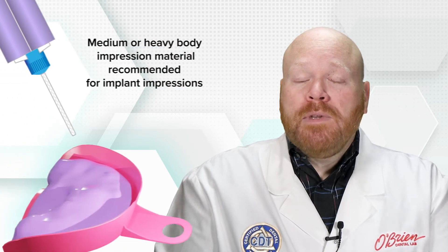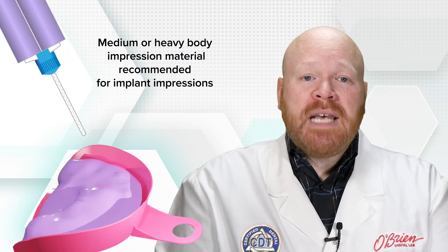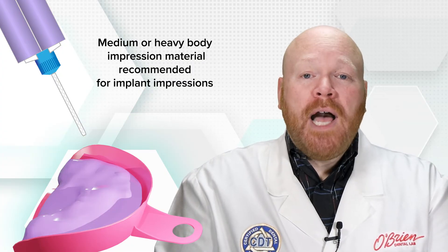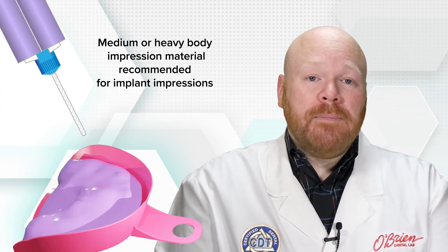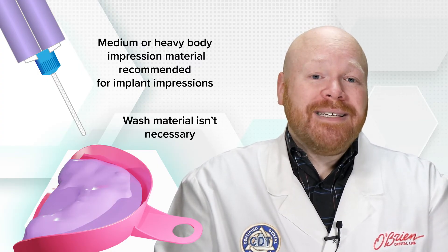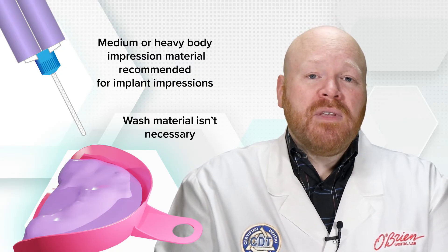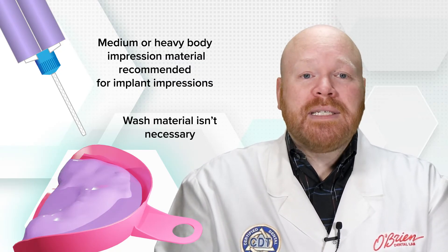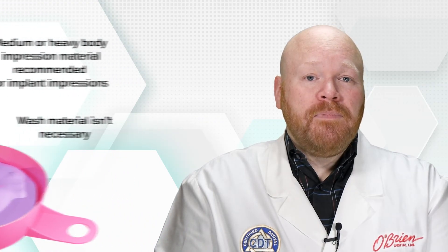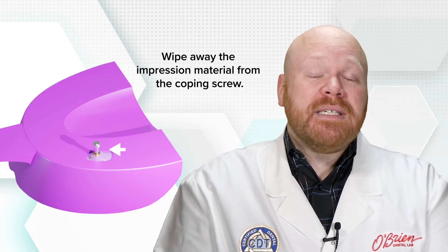It's recommended that you only use medium or heavy body impression material for implant impressions, as the greater viscosity will help to maintain positional accuracy. Since you aren't trying to capture a margin, the wash material isn't as necessary. If you do use some light body material, just keep it to a minimum so that the majority of the impression coping is captured in the heavier material. After you've placed the loaded tray into the mouth, it can be helpful to wipe away the impression material around the portion of the impression coping screw that's sticking out of the tray.